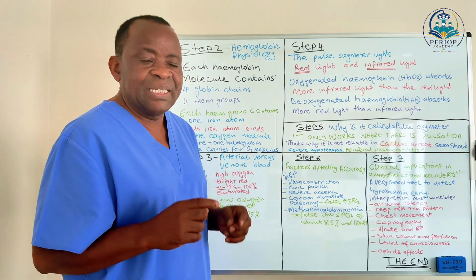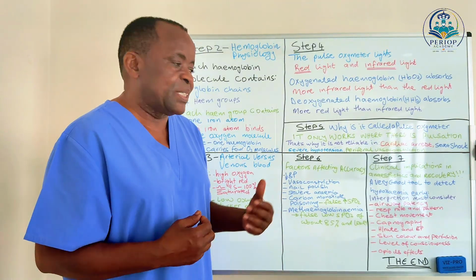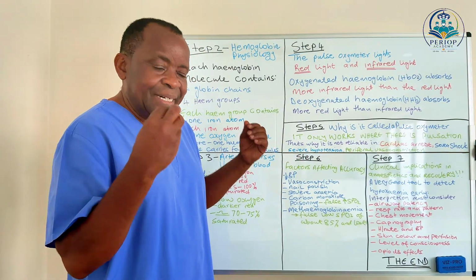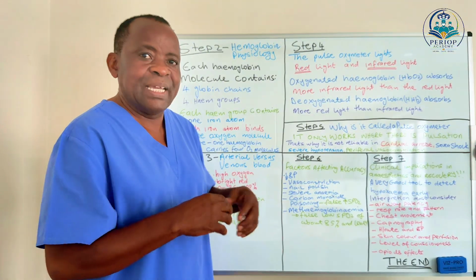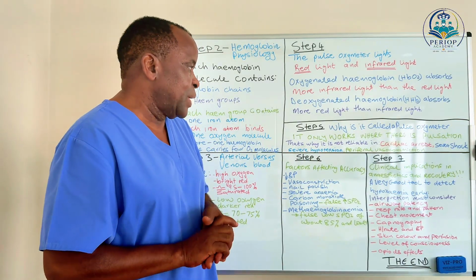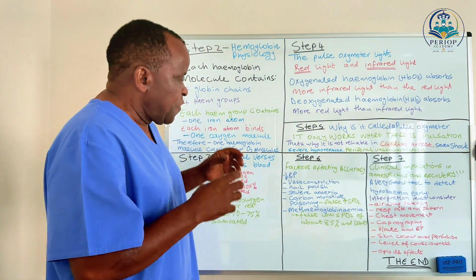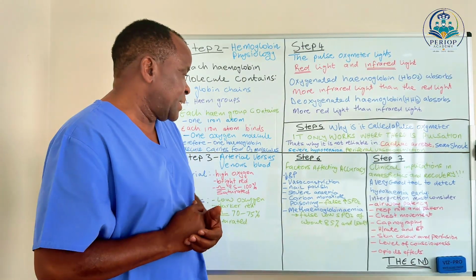And in severe hypotension, for the same reason, when an individual is severely hypotensive, the saturation is not as reliable for the same issues which I discussed before: vasoconstriction, peripheral shutdown, and blood being redirected elsewhere. And in this case, we now want to look at factors which affect the accuracy of pulse oximetry.